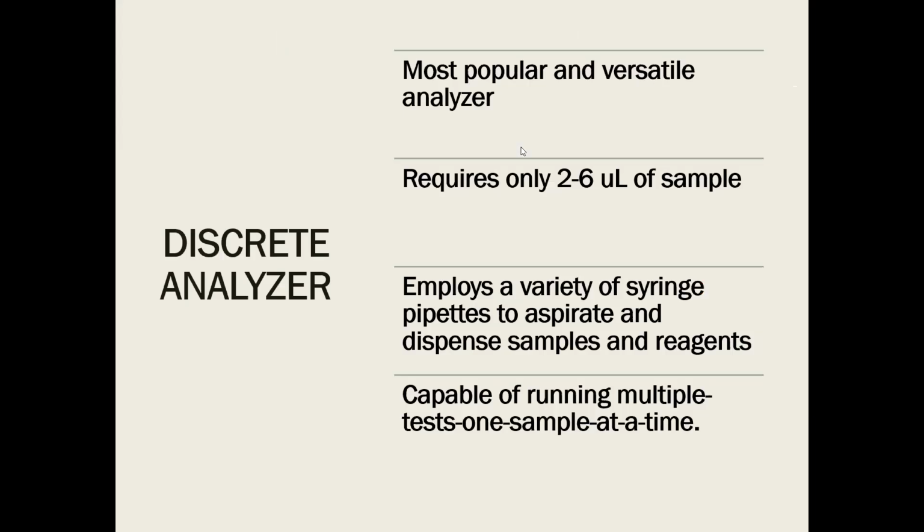Next in line is your discrete analyzer. As compared to continuous flow, discrete is your most popular and versatile analyzer.